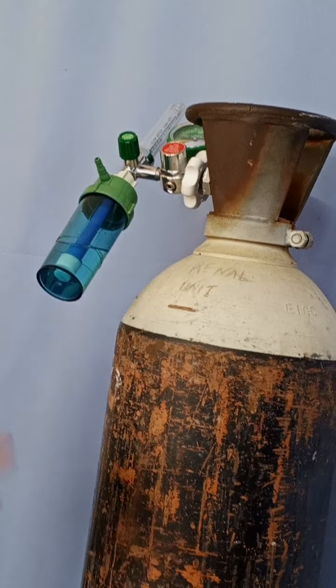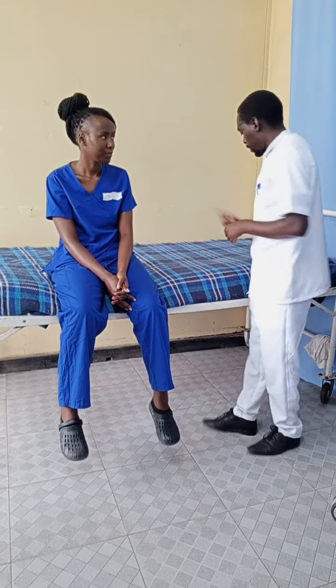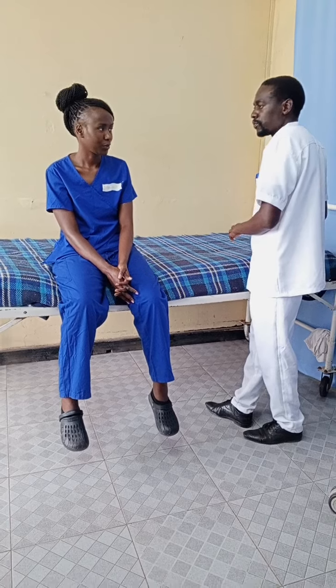All right, so what I'll do now, I need to talk to the patient. Good afternoon, madam. I'm student number 2. I've been assigned to administer oxygen to you since the oxygen saturation is low. Permission to go ahead. Is there anything that I can do within the hospital? All right, so I'm going to prepare.